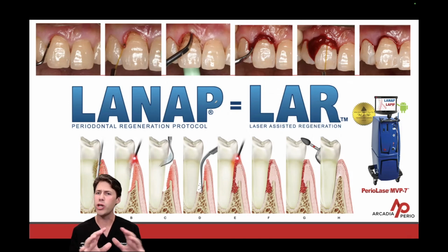But I want to give you a good general overview just to recap what is LANAP and what is LAR when it comes to treating either generalized periodontal disease or localized periodontal disease.